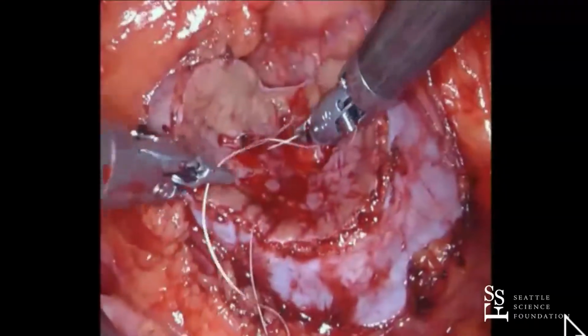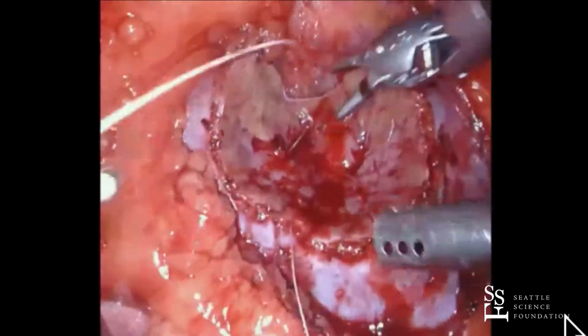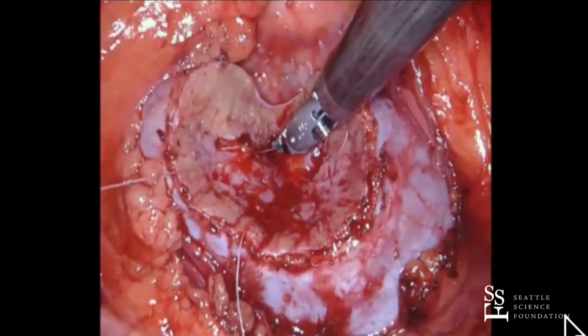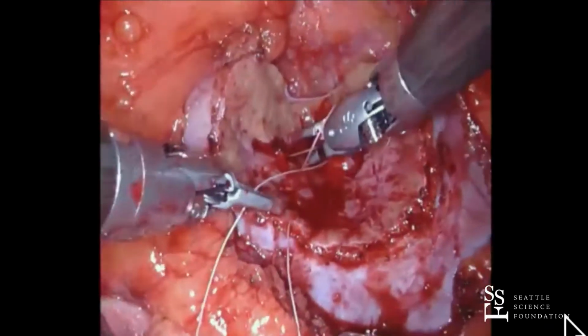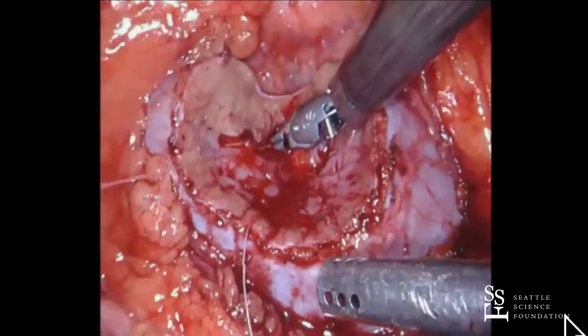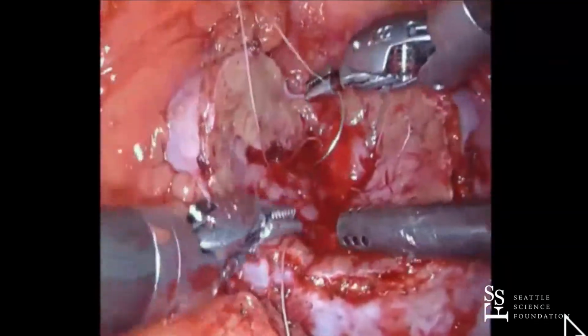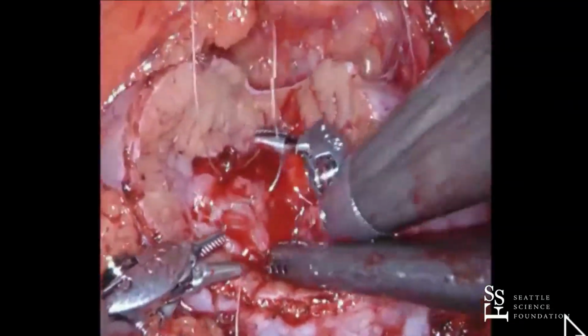You can do this with V-lock. I used V-lock for a while. I just didn't like the characteristics of it in the tissues, and maybe I was pulling too hard. The other thing is I was using V-lock and not Quill or the Stratafix, which is, I think, a little less aggressive as far as the barbs.